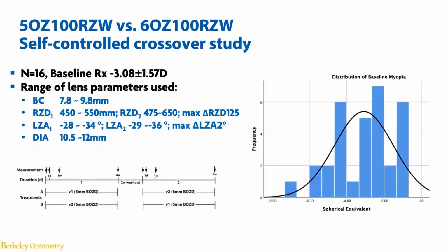So with that understanding, we have decided to use the design of a 5mm OZ combined with a 1mm return zone width. Again, that means the extra 1mm has a 0.5mm extra in each side, all contributing to the landing zone. So we want to use this design to compare the original 6mm OZ design.